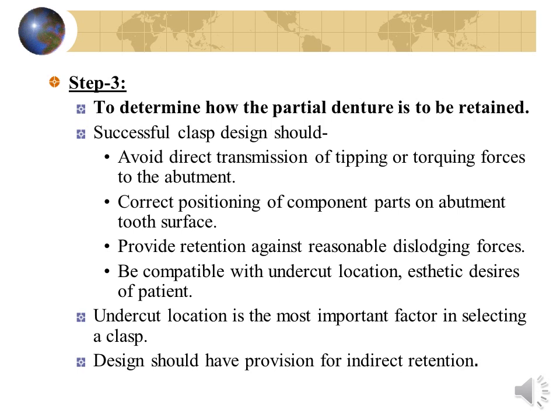Location of the undercut is the most important single factor in selecting a clasp.